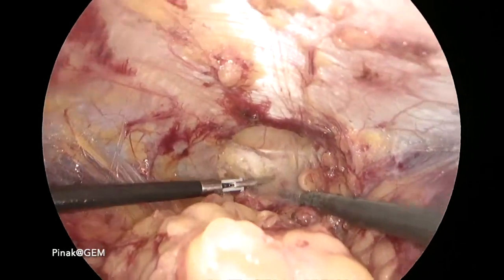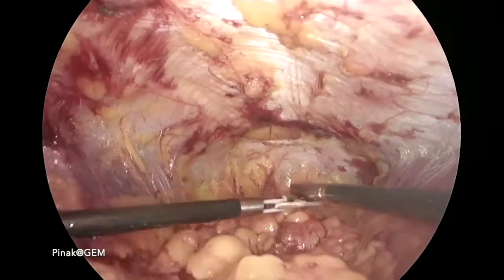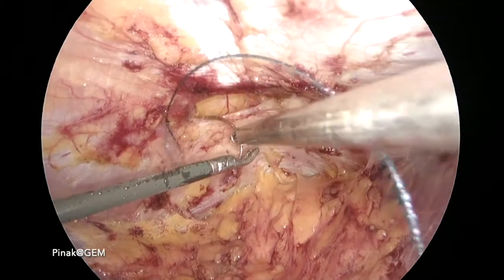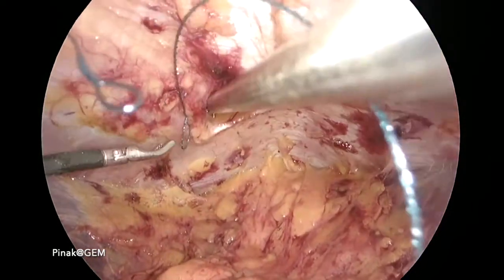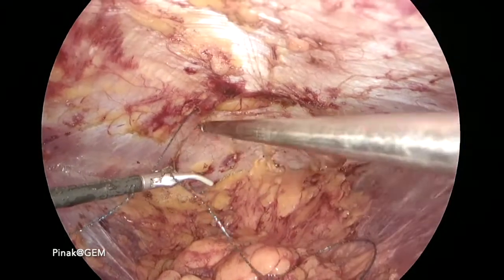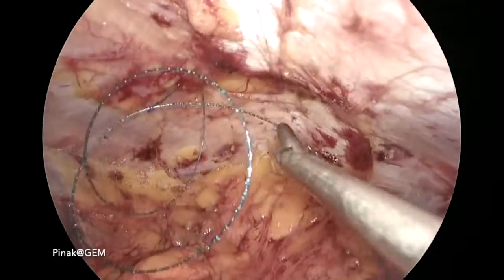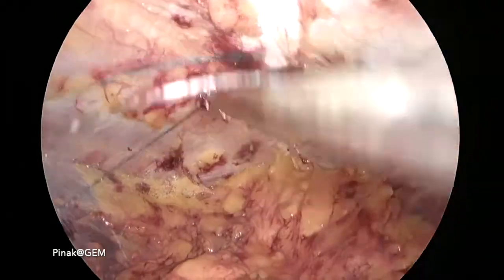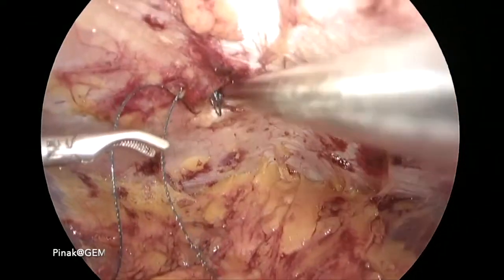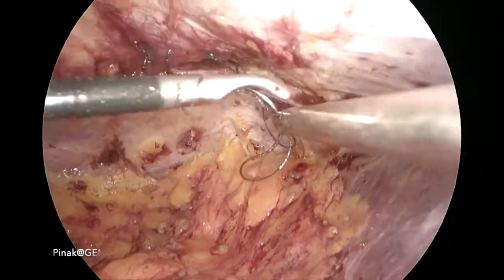Once we have adequately dissected, a large pocket is ready. Now the defect is closed again with a V-lock suture in a continuous fashion. Once the defect is closed, the entire dissected area is measured, and in this case we have put a 15 x 12 cm mesh to cover the hernia defect.